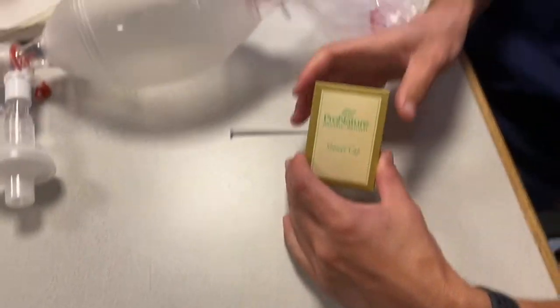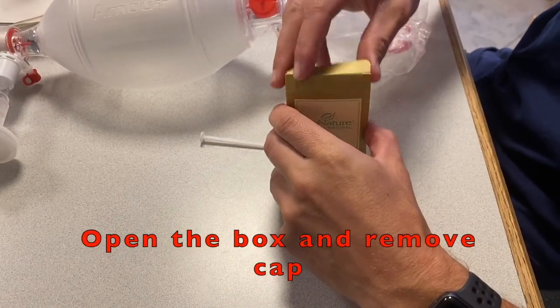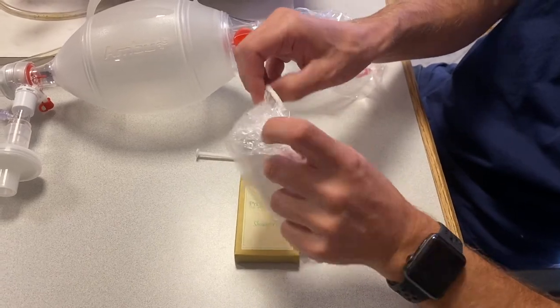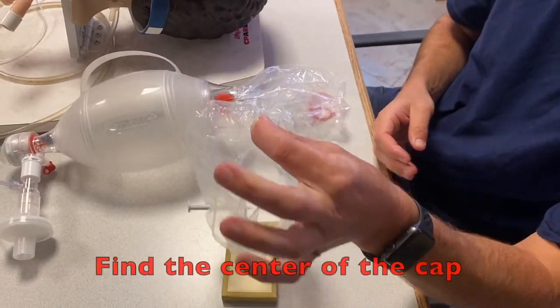The disposable shower cap method is quick and easy. First thing you want to do is open the box, go ahead and pull the shower cap out, and fully open it so you can get a good look at the entire shower cap — make sure there's no holes in it and that it's intact. The next thing you want to do is find the center point of the shower cap and mark it with your finger.